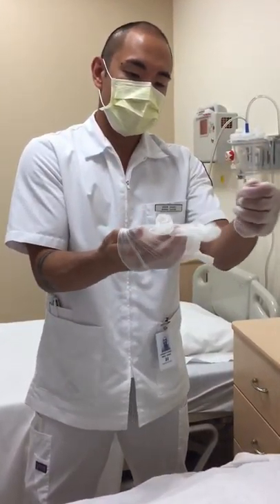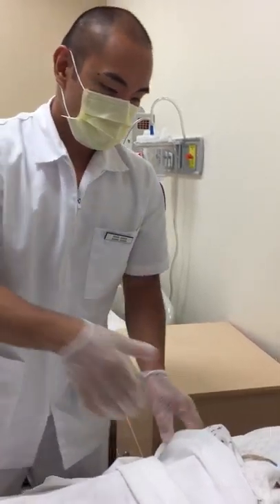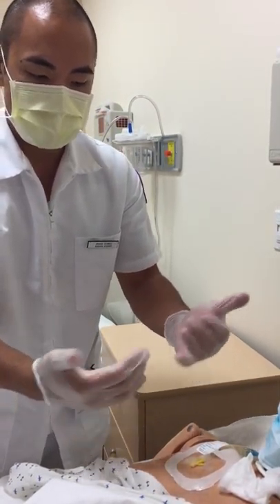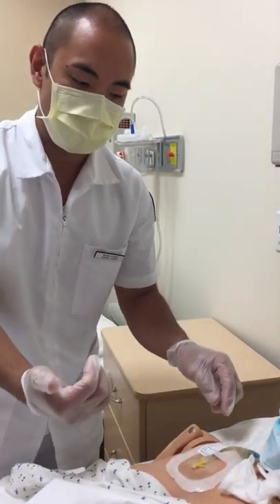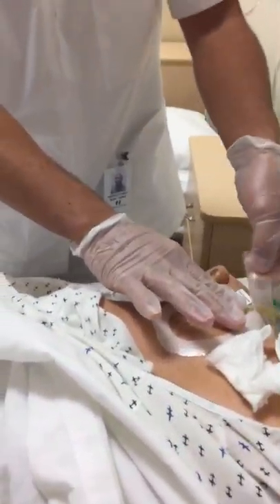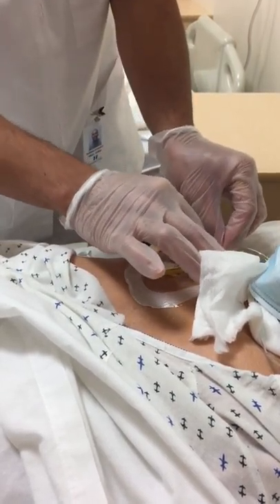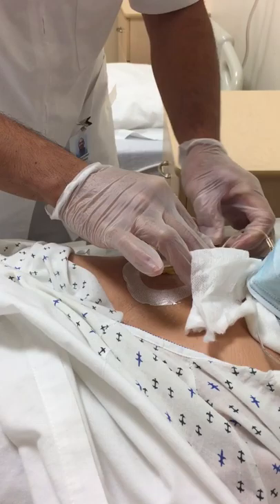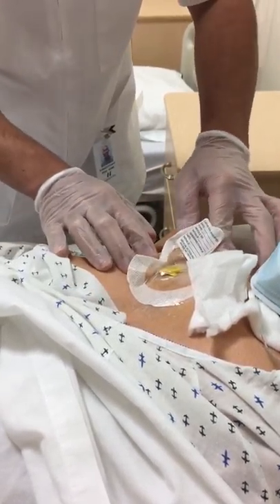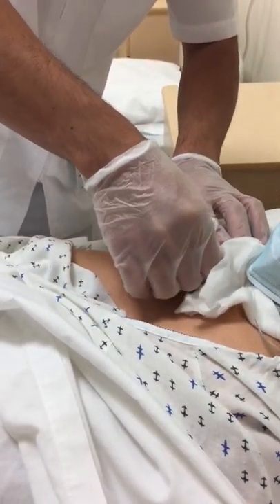My clean gloves are on. Okay Mr. Alvarez, I'm going to go ahead and drape you slightly — I'm just going to take a look at that central line. Here you can see the dressing. I'm going to take note of any blood, swelling, or redness, and also remove this and take a look. When removing this, you want to hold the skin taut and secure the line. I'm trying to hold the skin as taut as possible to make it less painful for the patient. When you get close, you want to secure the line.